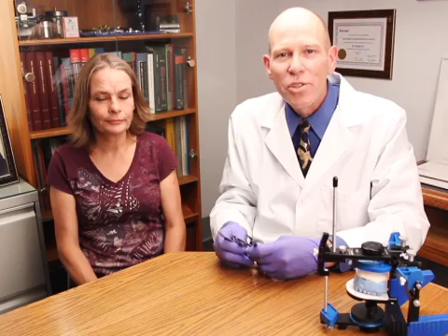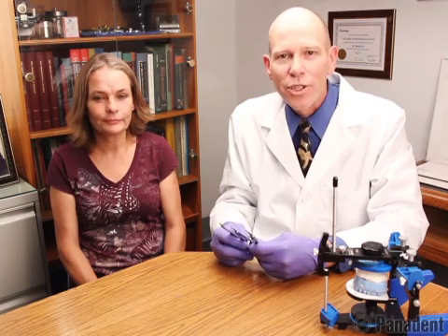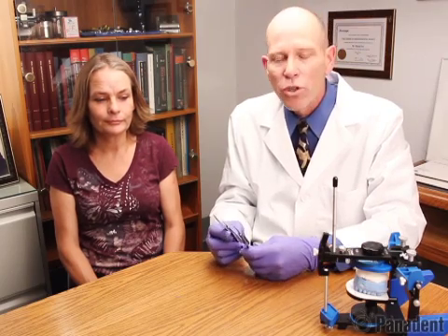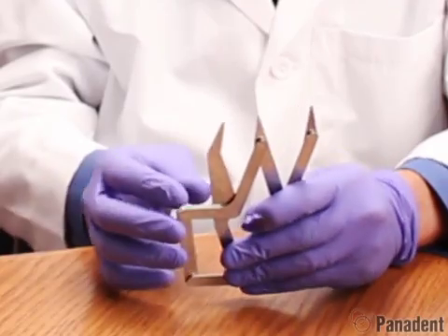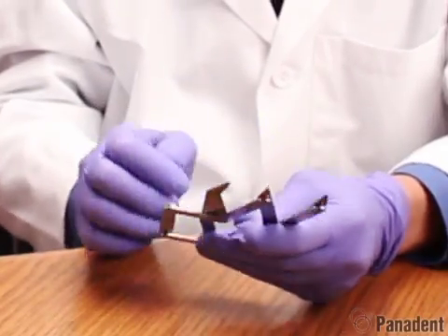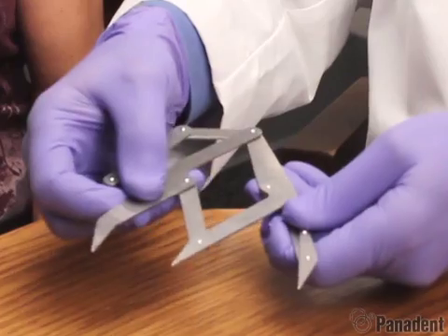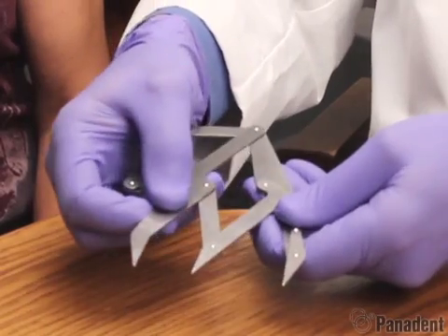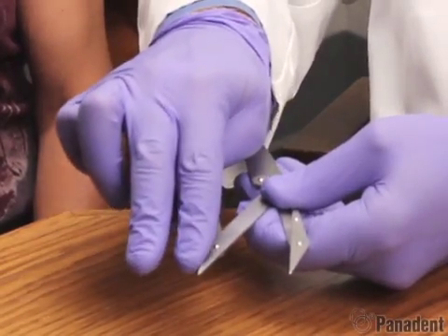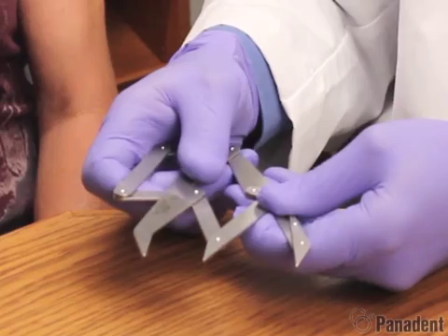Hello and welcome to my demonstration of the use of golden proportion in articulation. The golden proportion ratio is a ratio of 1 to 1.618. We have the golden ruler here that maintains that golden proportion ratio. In other words, whatever this distance is, this is approximately 60% wider.